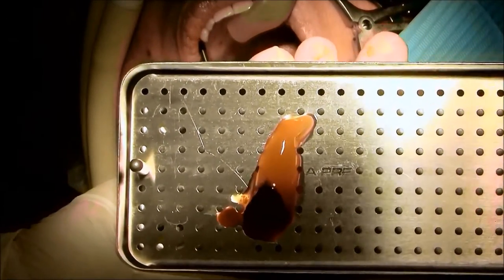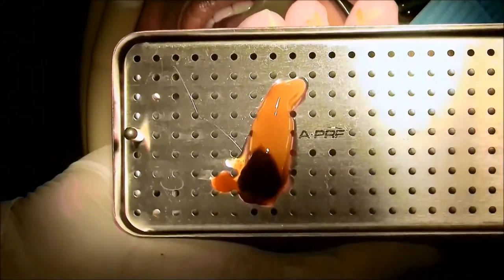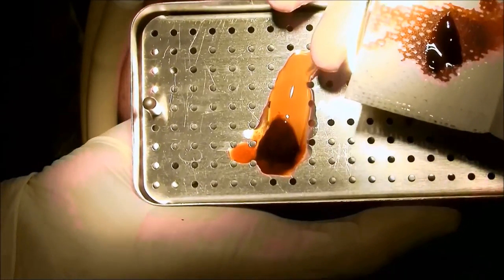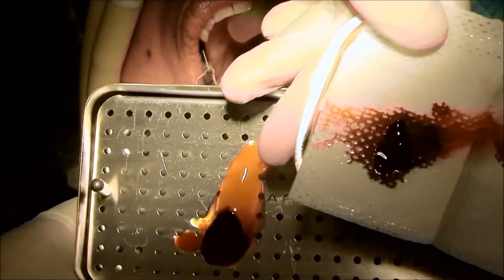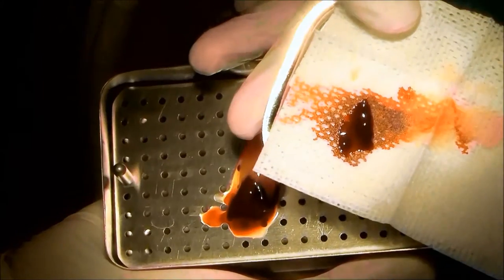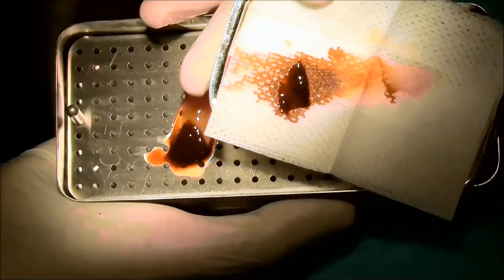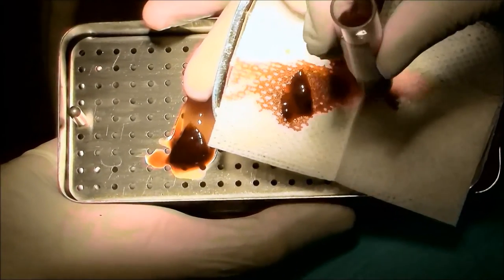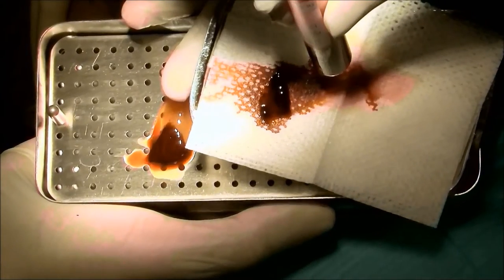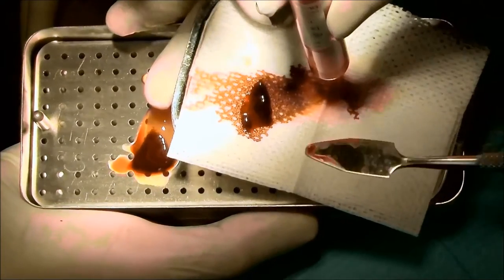We're going to also demonstrate how we pick up the fibrin — we're going to do that right close to the camera — and we're going to demonstrate how we harvest the fibrin.